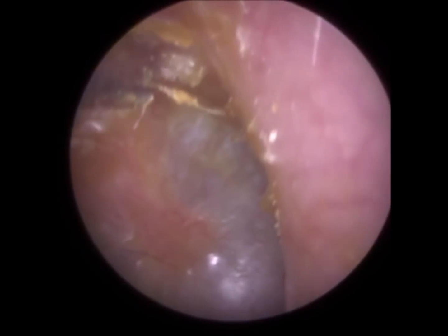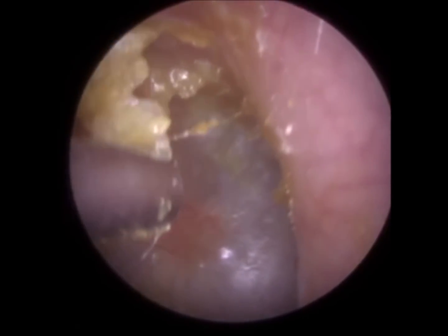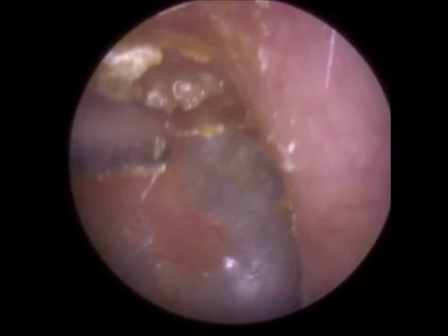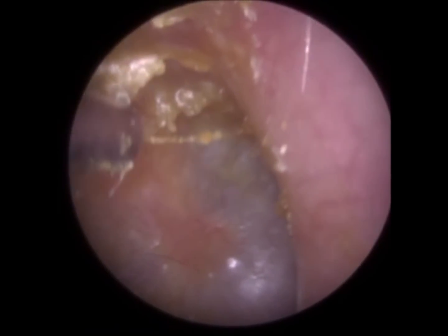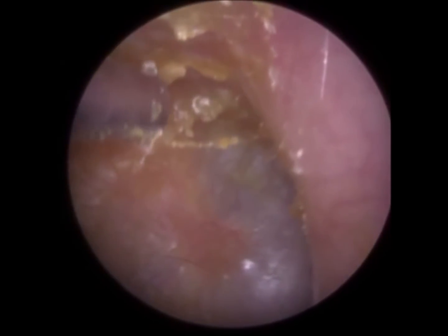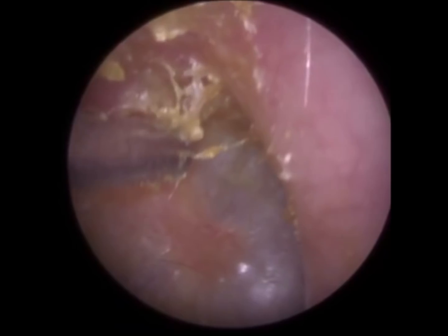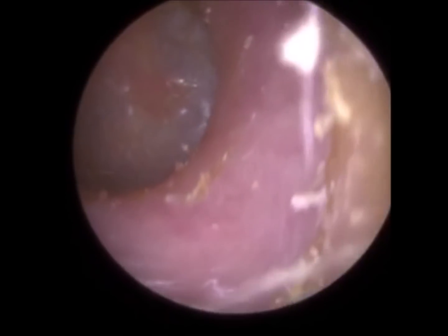So I'm just at the top part of the ear canal. As the patient was very still and I felt confident enough, I just try to remove as much as I can. But in essence, the procedure is kind of complete already. The patient is taking some medication for his otitis externa. It's important with otitis externa, especially, you want to avoid water entering your ear. Water can exacerbate the condition.